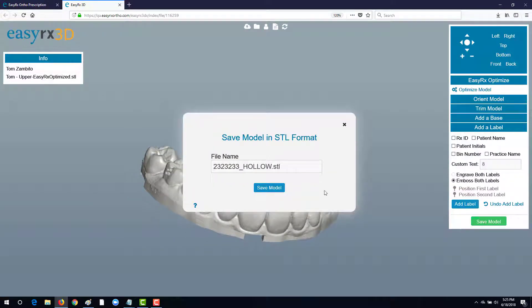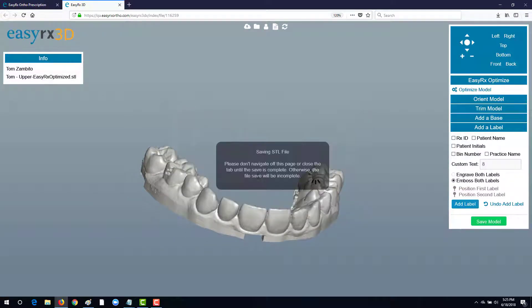We're going to save model, click save and once the models have been finished they will be accessible for printing.